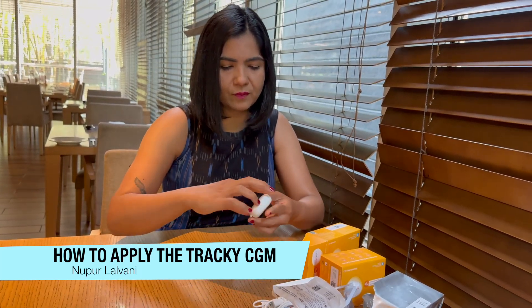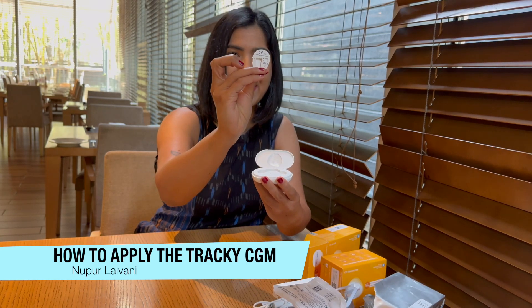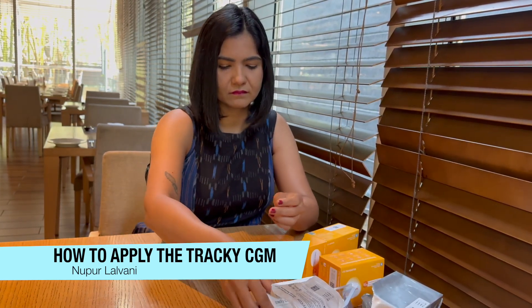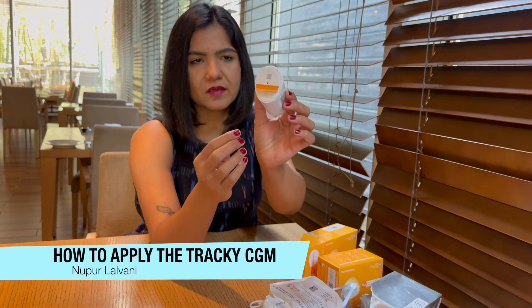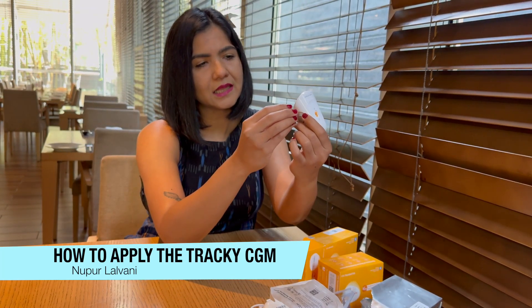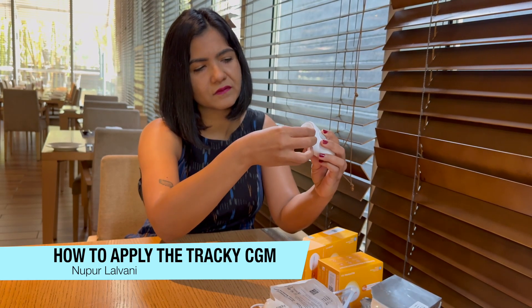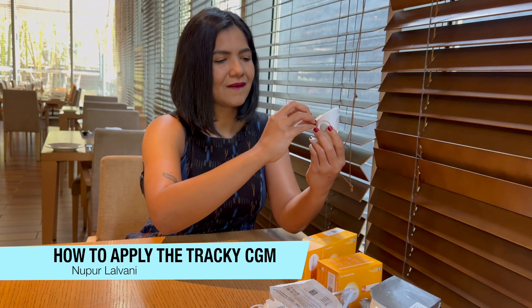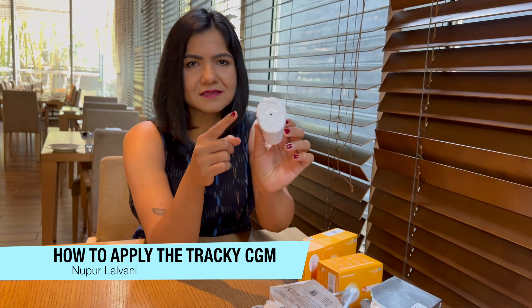I'm going to remove my transmitter from the charging unit. That's my transmitter — this is the back of it and this is the front of it. My transmitter is fully charged. You can see there's a little tape on here that you need to peel off. I'm going to peel this off, and then I'm going to peel the other side off as well. So I'm ready now — you can see this is ready to apply.